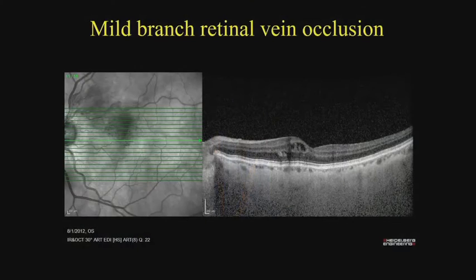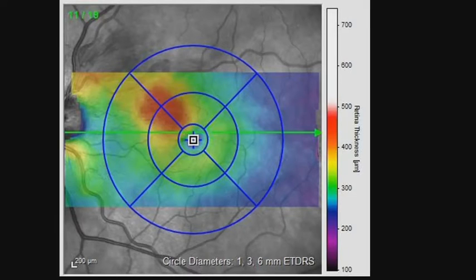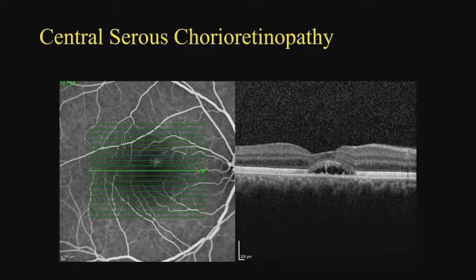For mild branch vein occlusion, sometimes it works very well. And again, you can argue that you can just leave them alone, and I can argue that again and again. Like this case, you've got an edema, there are a few spots of laser, and then they kind of work. So I'll skip through that.